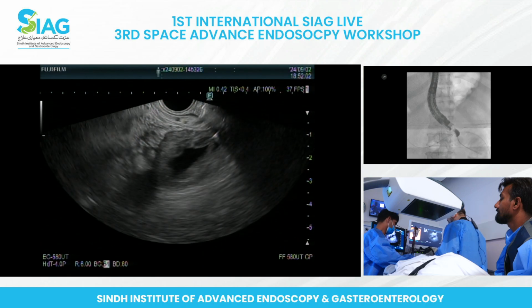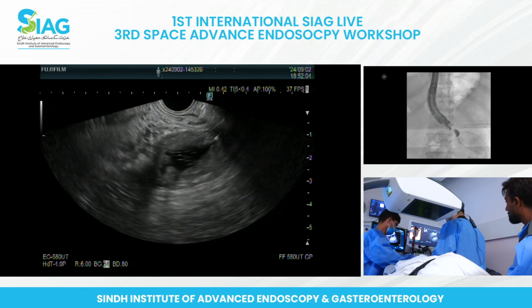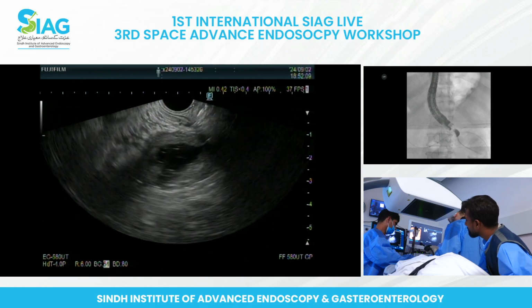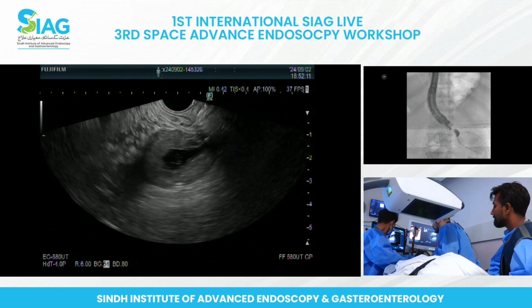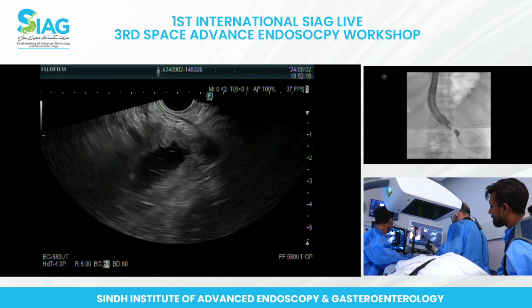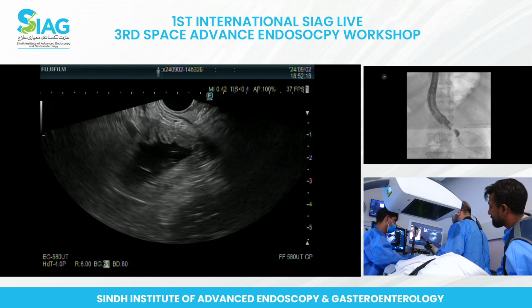So when you see me tenting like this, you can see that the actual distance is not going to be more than 10. If this is the tip, we can see that. Yeah, you can see that, right? So I'm just now going to look for this, this is what I would love to be able to do it in.